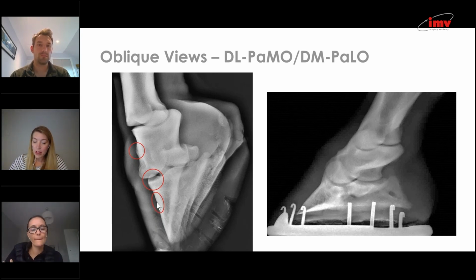And so this is something you would only, I feel, see in these views. Again, this is just personal experience. But you'd often see that in horses with perhaps atypical laminitis or subclinical or chronic laminitis. So I think this is a predilection site for modelling, and certainly it's also something you'll see on MRI as well.